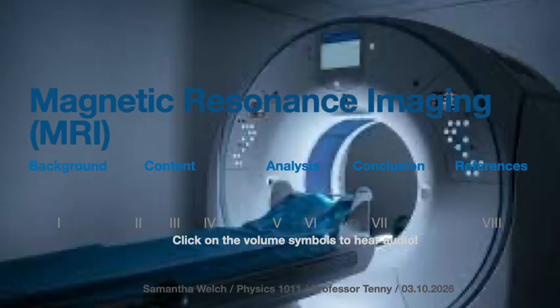gallbladder. According to information published by the University Hospital Southampton in the United Kingdom, MRCP MRI scans sometimes may involve an interesting preparation step. The fun fact is that patients may be asked to drink pineapple juice before the scan. The reasoning behind this is that pineapple juice naturally contains compounds that suppress signals from fluids in the stomach and digestive tract. By reducing those signals, the MRI scanner can produce even clearer images of the bile ducts and pancreas.